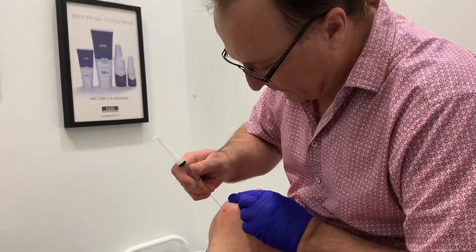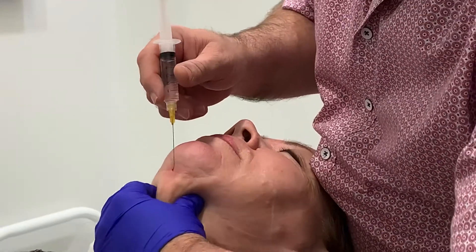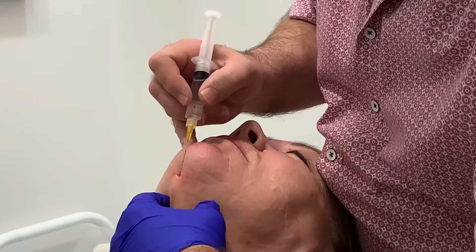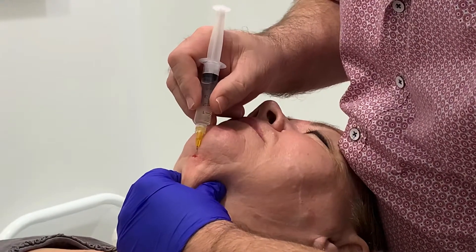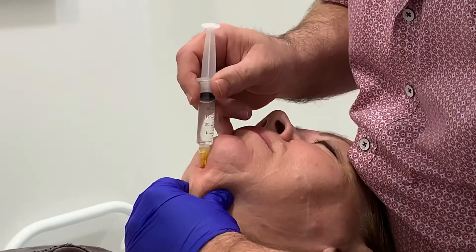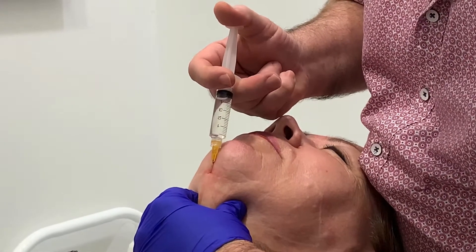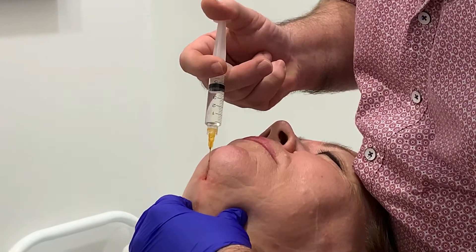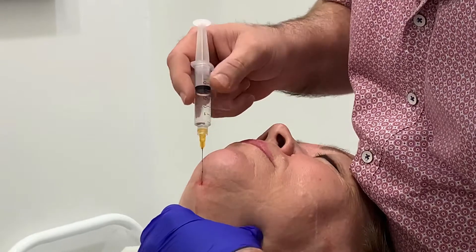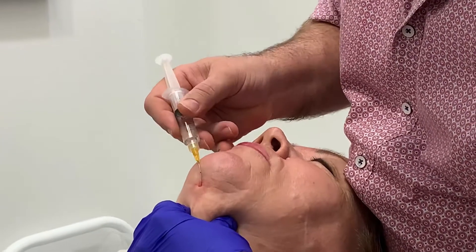Do you have any pain? No. Okay, good. So what I'm going to do now is I'm going to treat it in an almost pyramid type fashion. I can feel some of the subcutaneous tissue there and I'm just putting my cannula in and I'm gently retrograde injecting as I go. I'm going to come back to the area where I can feel the fatty deposits that I want to treat.